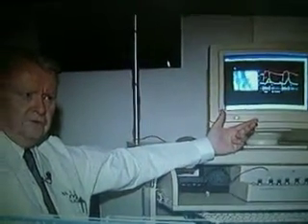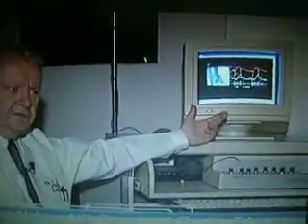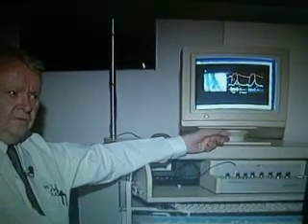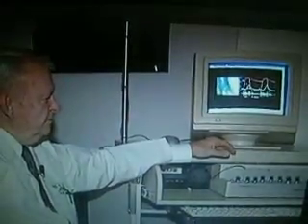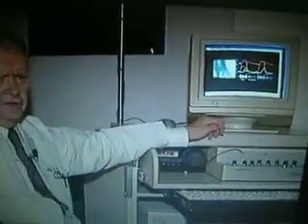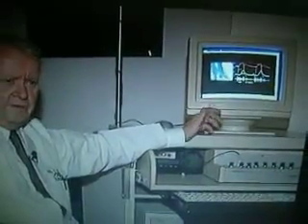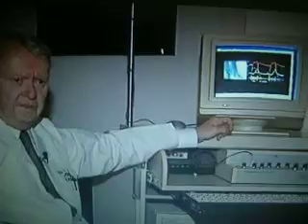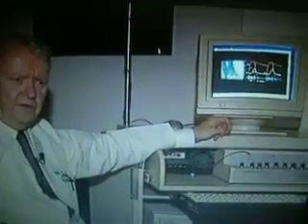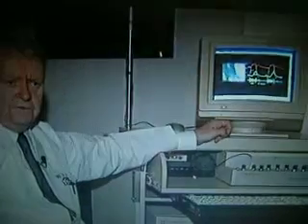So my experience with this equipment through a lot of years and through a lot of students and house officers is that the simulated events and the recorded real-time events have appreciable increase in their abilities at the bedside. One can record the actual bedside events in patients, let's say, with some unusual variety of heart sound or murmur, and place them on the hard drive of the laptop computer and subsequently put them on a CD with the anticipation that after a period of time and collecting enough of them, you can actually make a teaching CD that would be easily and inexpensively provided to students.